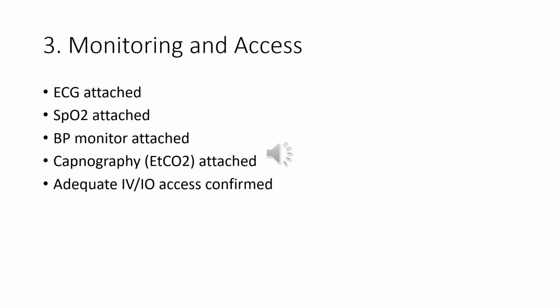It is important to ensure ECG, SpO2, blood pressure, and capnography monitors are attached. Continuous monitoring allows for early detection of hypoxemia, arrhythmias, or hypotension. Adequate IV or IO access ensures rapid administration of drugs and fluids if needed.